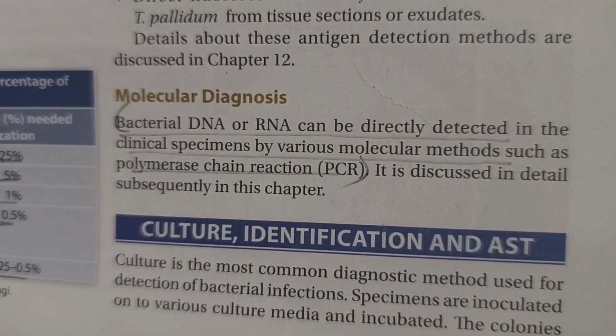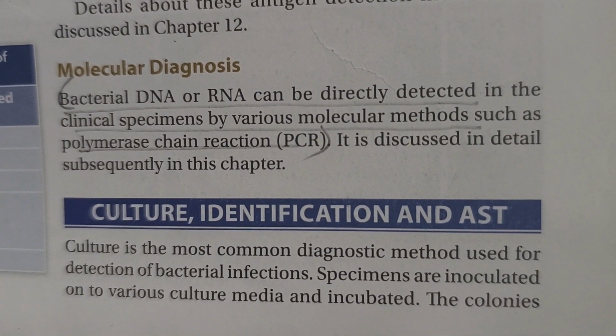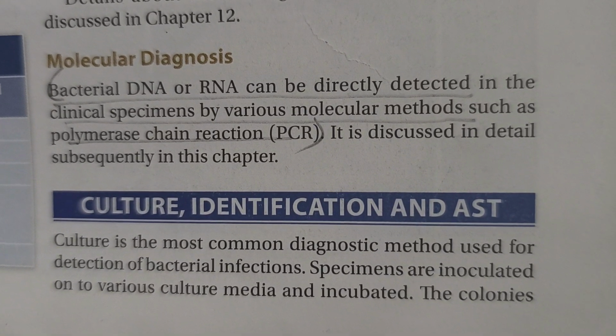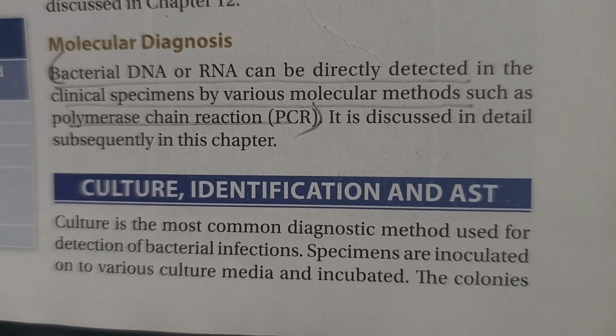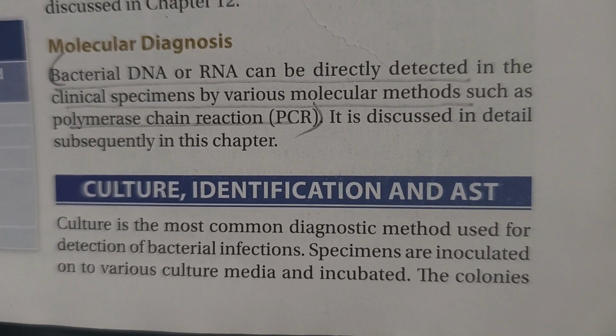Molecular diagnosis. Bacterial DNA or RNA can be directly detected in clinical specimens by various molecular methods such as polymerase chain reaction. Culture identification and AST.